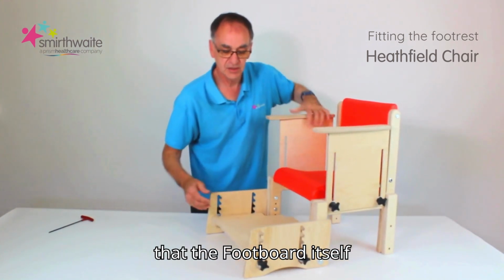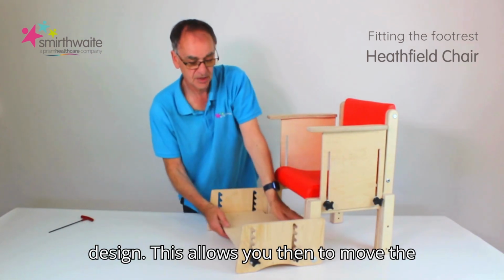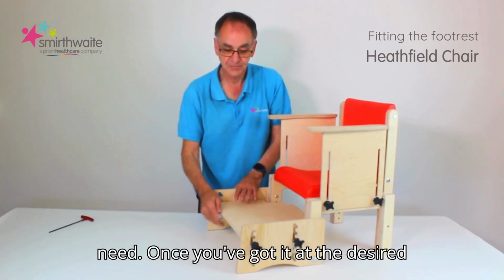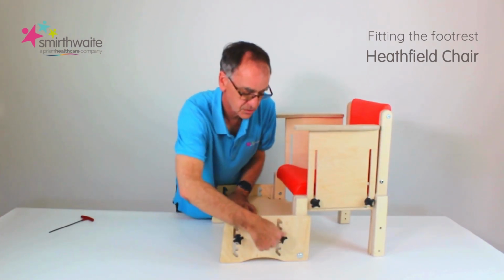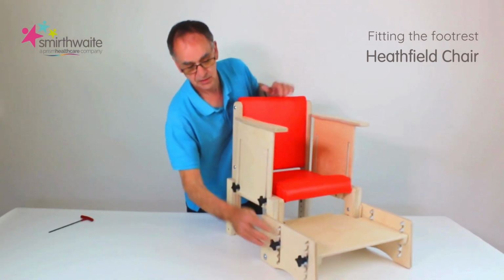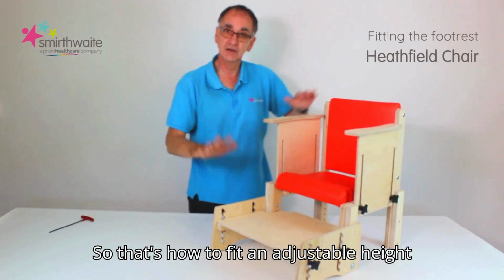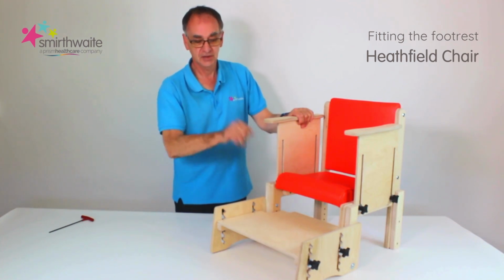And you'll notice that the footboard itself has a toothed design. This allows you then to move the footboard forward and locate it at whatever height you need. Once you've got it at the desired height, simply tighten the hand wheels on either side to make sure that everything is good and secure. And there you are. So that's how to fit an adjustable height footboard and how to adjust the height of the footboard itself.